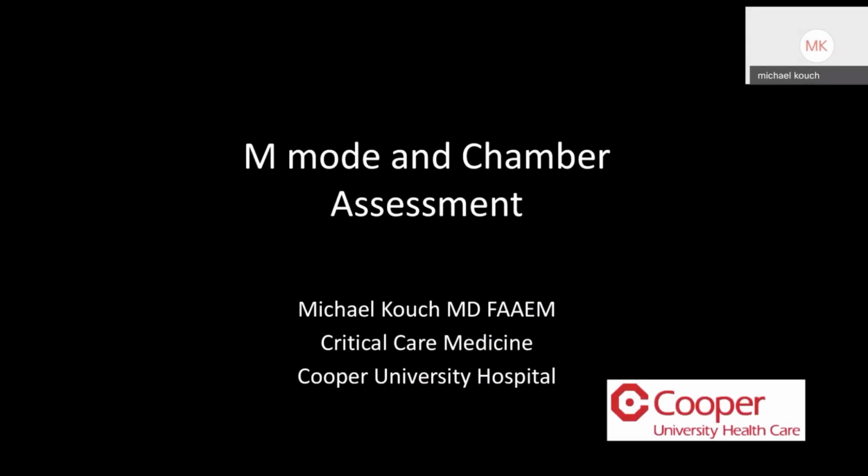When developing a question for a board exam, you would want it to be something very straightforward, that you could have visual pictures or videos for, that would be very high yield. And so M mode fits that mold perfectly. So it's actually pretty high yield on the boards.